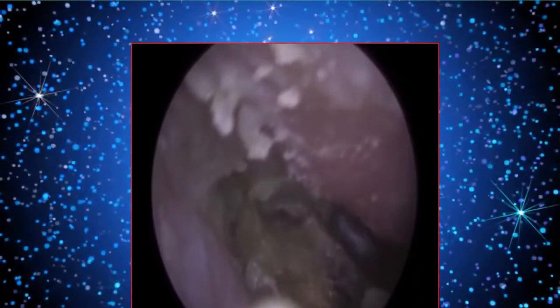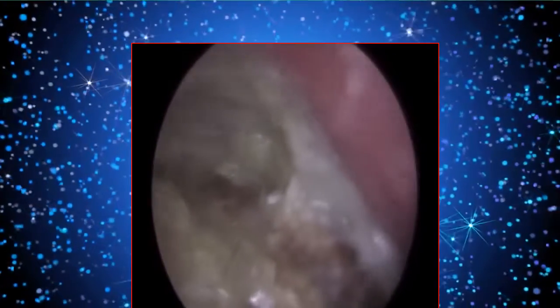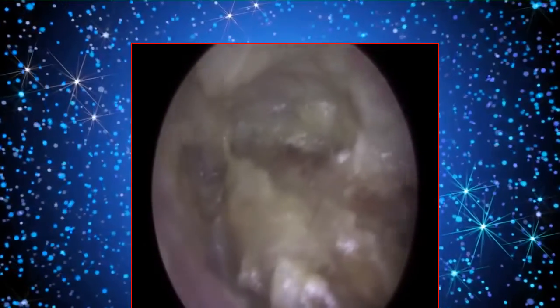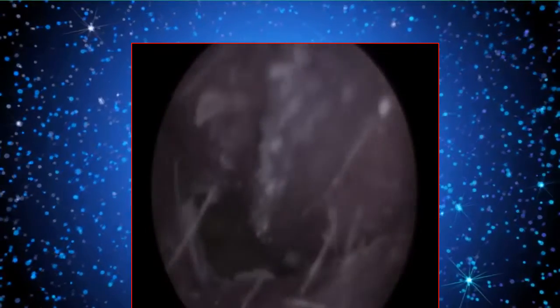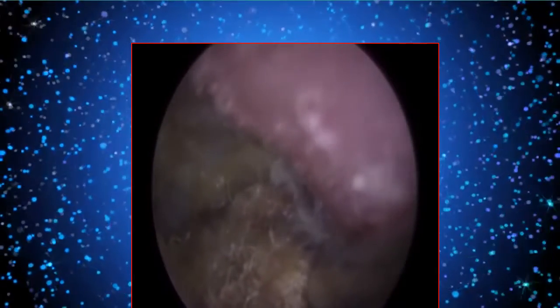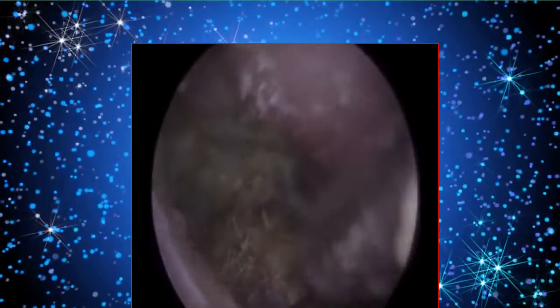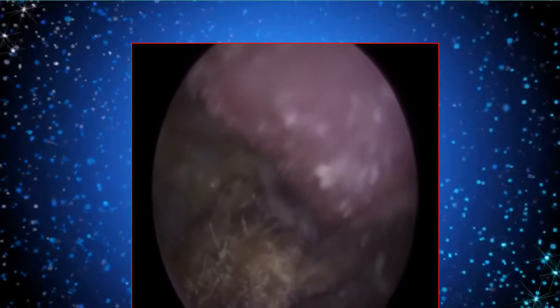A forceps, the debris is too squishy, and it'll just bite away. And in fact, the ear hook initially pushed it further in. I've kind of made his ear slightly worse. I've lodged it further in. I just couldn't get behind it. It's so deep. Sometimes what's good is when there is a bit of swelling, because obviously, as you probably know if you've been watching my videos, the inner two thirds of the ear canal is skin on bone.